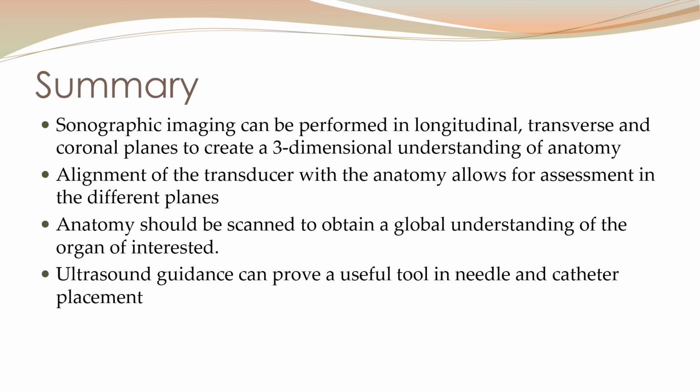And ultrasound guidance can prove to be a useful tool in needle and catheter placement. It gets more comfortable with more experience and practice, but it can be an excellent tool.